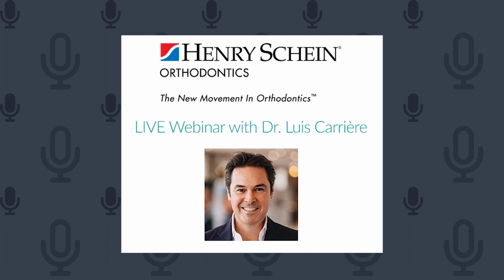Is it possible to treat a class 2 female patient, 53 years old, with a TMJ click and pain with the motion appliance and your protocol? Of course, because when you have a class 2 malocclusion and there is clicking and pain, you have an excellent opportunity to invite the mandible to establish a new relation with the maxilla. You cannot promise the patient that you are going to solve it, because we all know that temporomandibular disorders are multifactorial, with several factors that interfere.